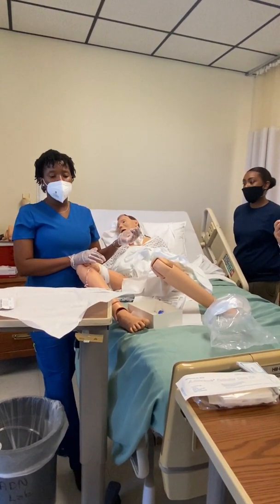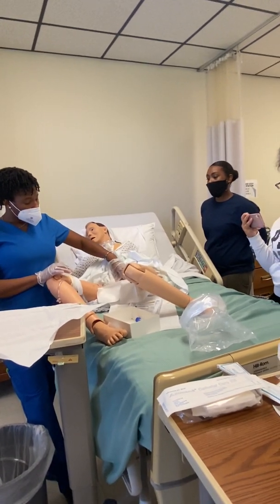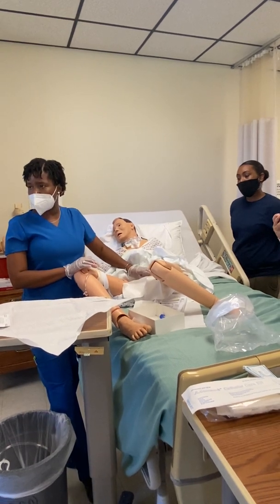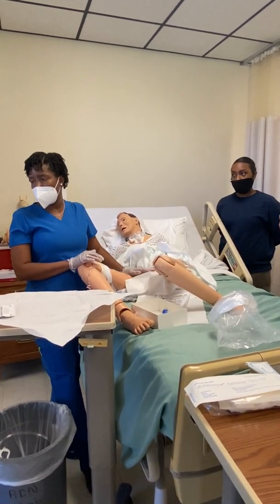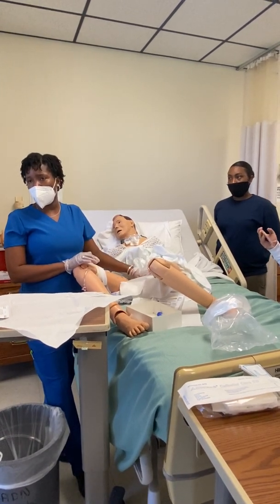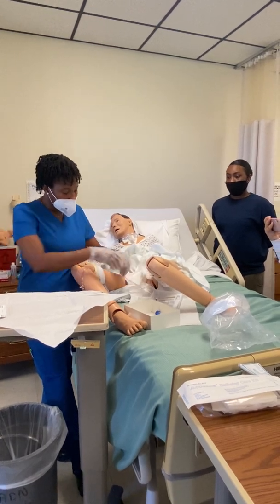To make sure the patient doesn't have a lot of urine sitting on their bladder, you can just press here on the symphysis pubis, right here where the pelvic bones connect, and it'll let you know. That patient shouldn't have pain there though. If they have a catheter and it's not leaking, then that means they're holding on to the urine, okay? But we're going to tell them to take a deep breath.